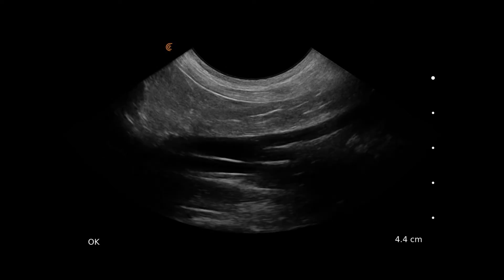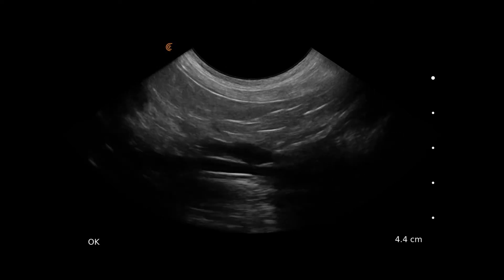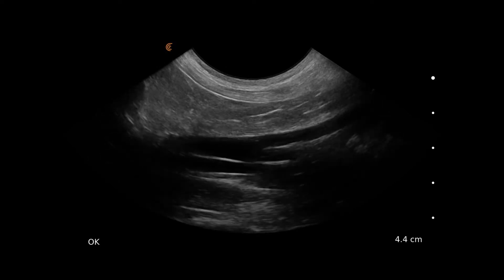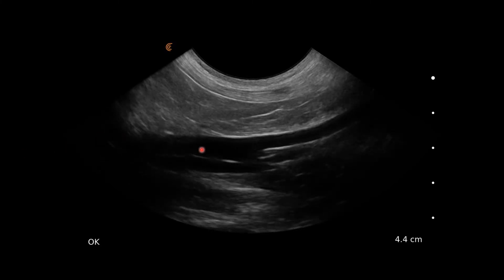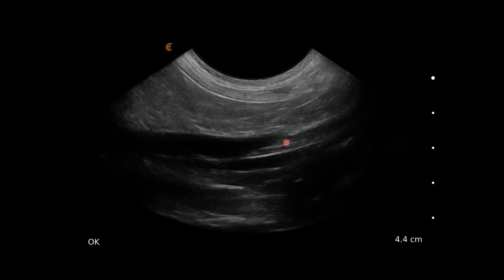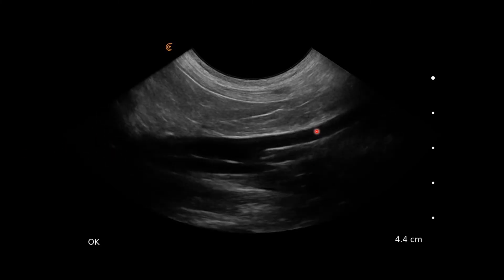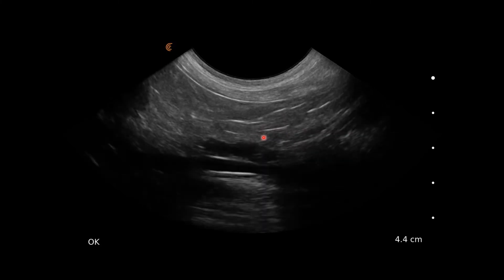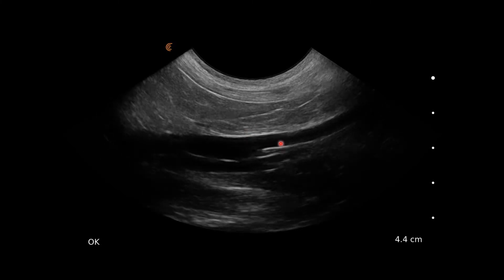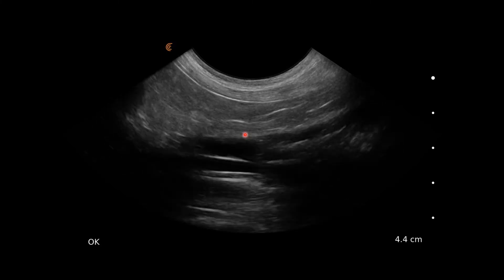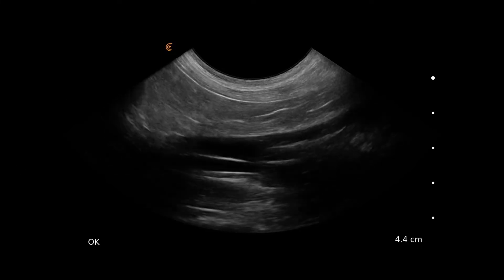We're following the aorta caudally to look for the left medial iliac lymph node. Here's the aorta and this is the external iliac artery. We're fanning in this region to look for the left medial iliac lymph node. There's none obvious here, so we presume that's normal.